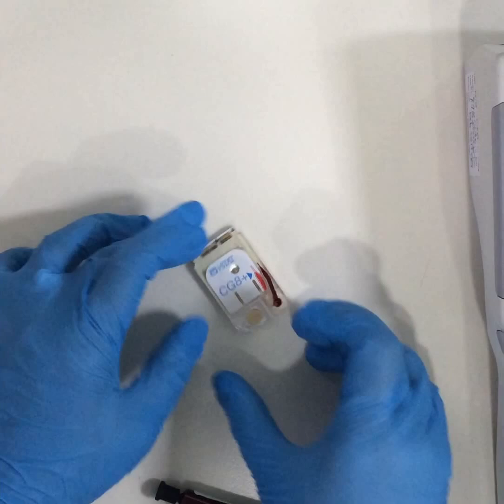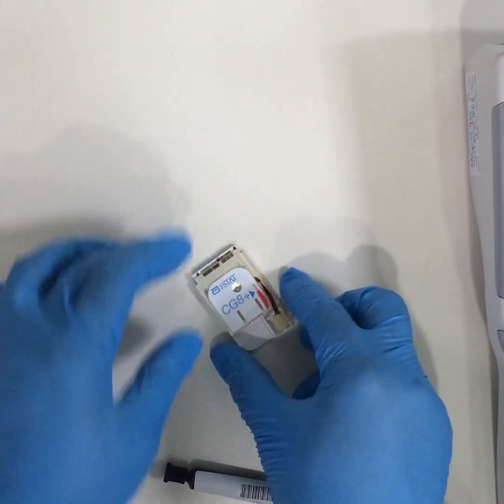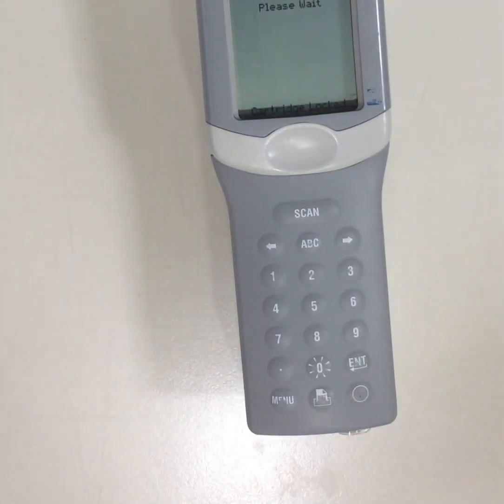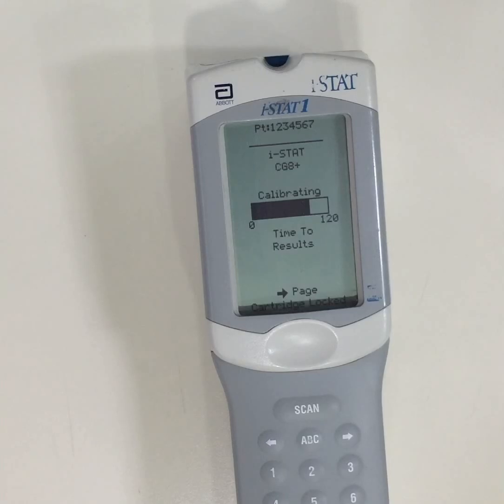We then close the cartridge and insert it into the blood gas analyzer. It would take approximately 120 seconds to analyze the blood.